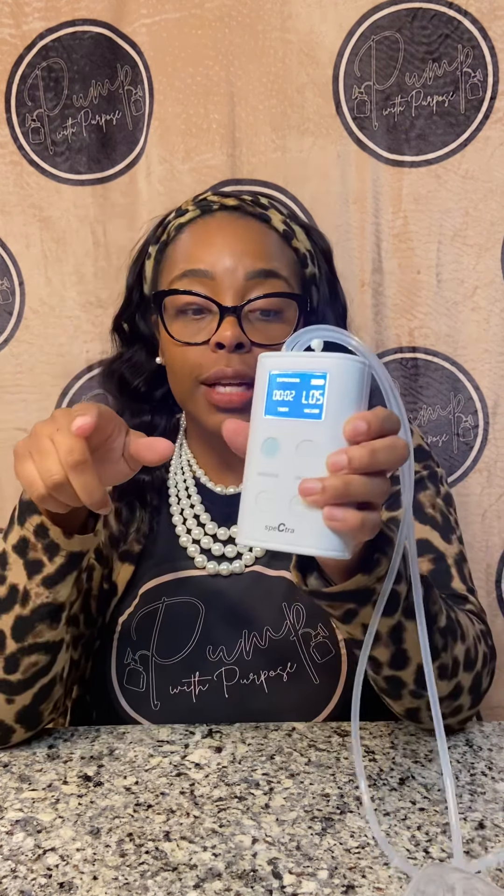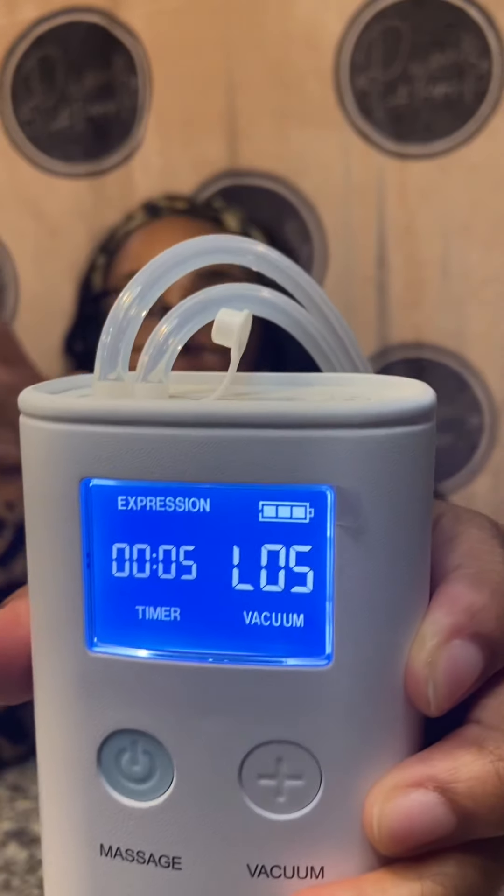As far as how the pump works, it's a very simple pump. Spectra is great because it allows you to customize the cycle and level, but on this pump it literally just has 10 predetermined options — there's no customization. You turn it on and it starts up. It is quiet, just like the Spectra pumps, though it doesn't give that same vibration.